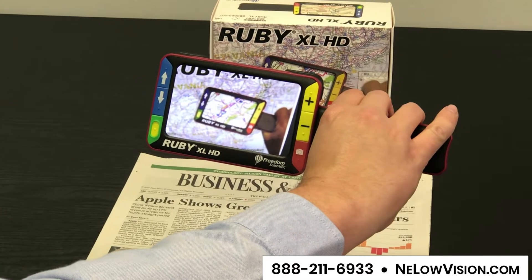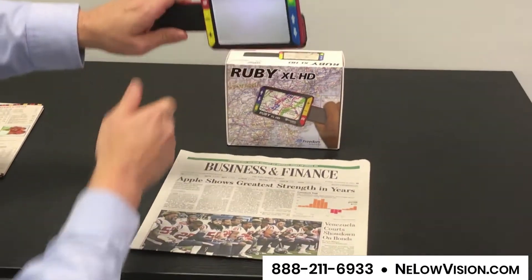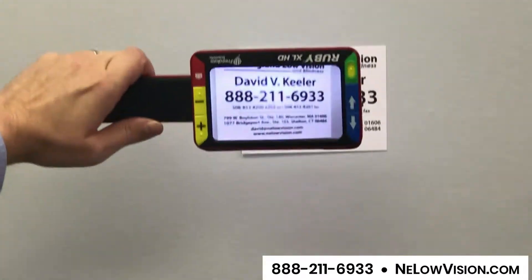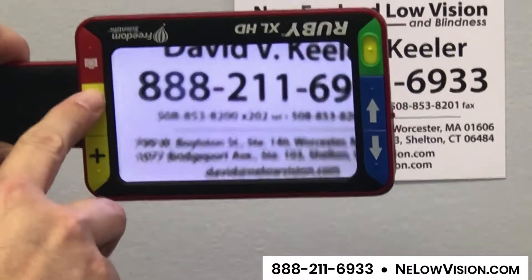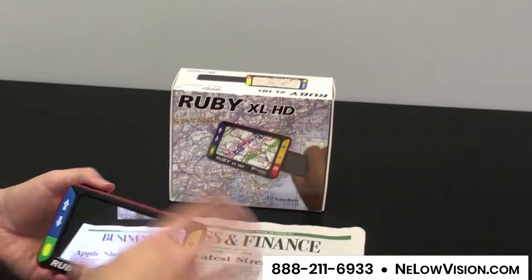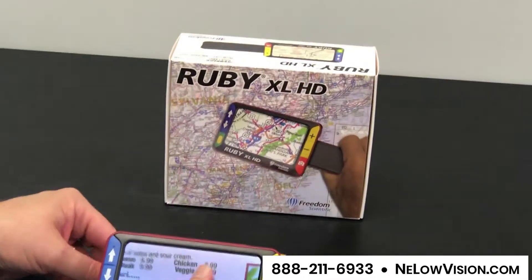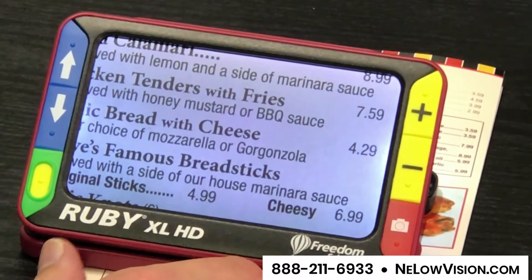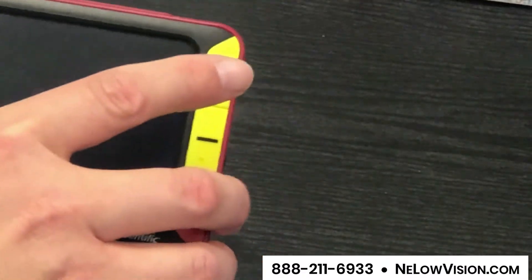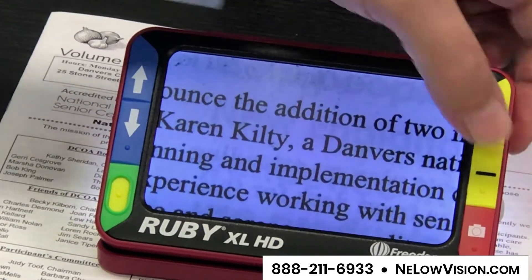This is very helpful when you're moving around your home and want to look at something on the wall, such as a placard, thermostat, or calendar. You can zoom right in, bring it into focus, and zoom back out. When you have the open stand, you can also look at menus when you're out and about, which is very helpful. If you're at your church, you may want to look at the bulletin — you can place that on there and increase or decrease the magnification.